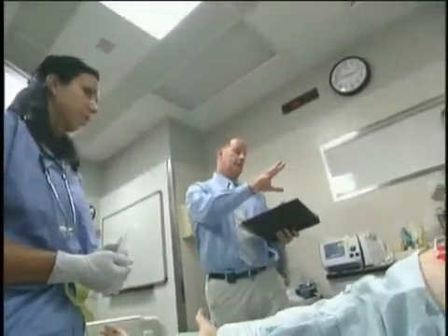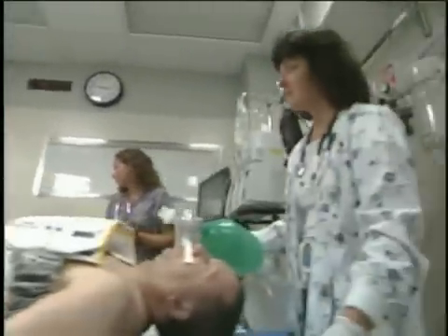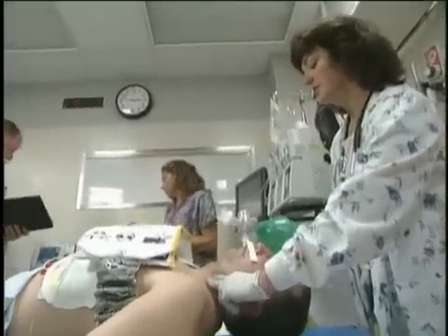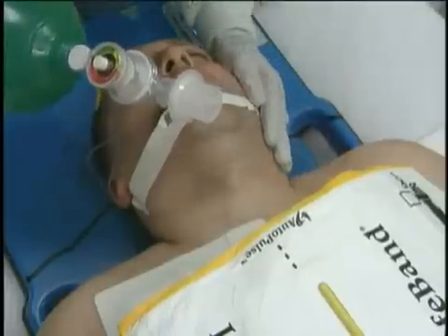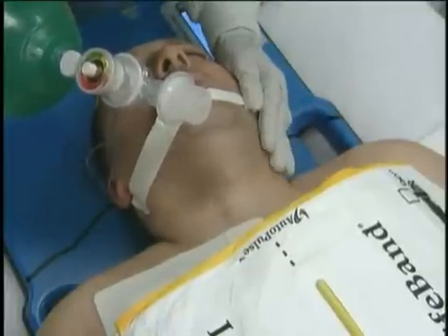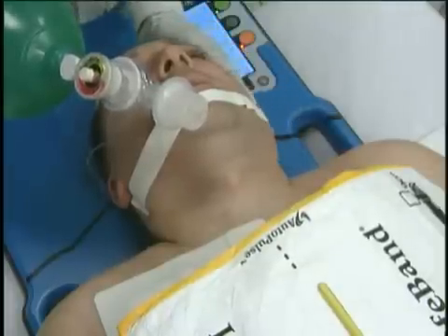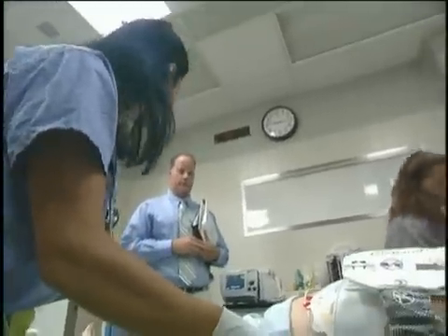I'm going to hold the auto pulse. Let's feel for any blood pressure, any pulse. The rhythm looks to be sinus. Does he have a pulse with that? We have a strong carotid pulse. Very good. You're okay, Mr. Spinetti. Let's get a second IV. Let's check a blood pressure, please. I'm going to talk to the family — she should be in the waiting room.